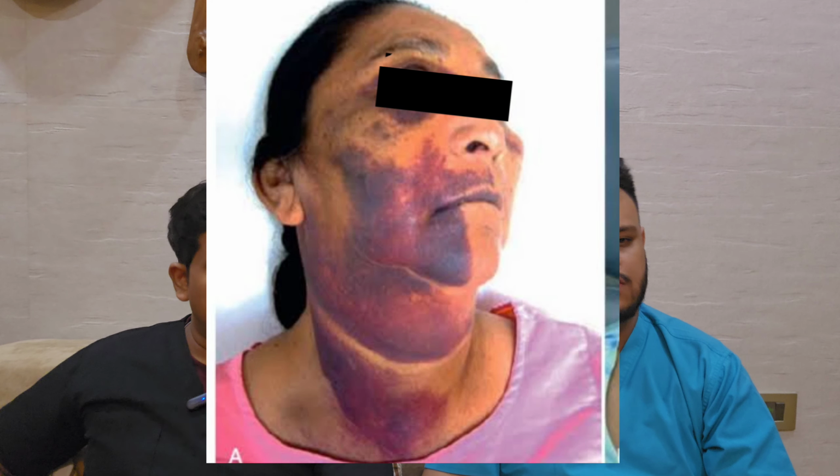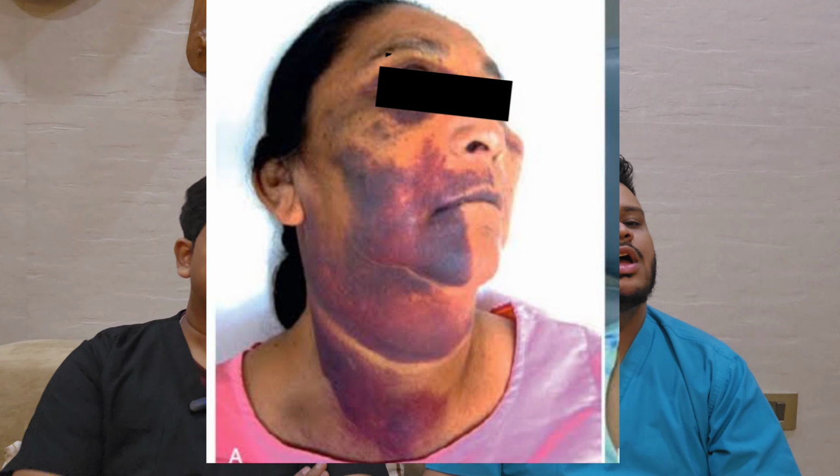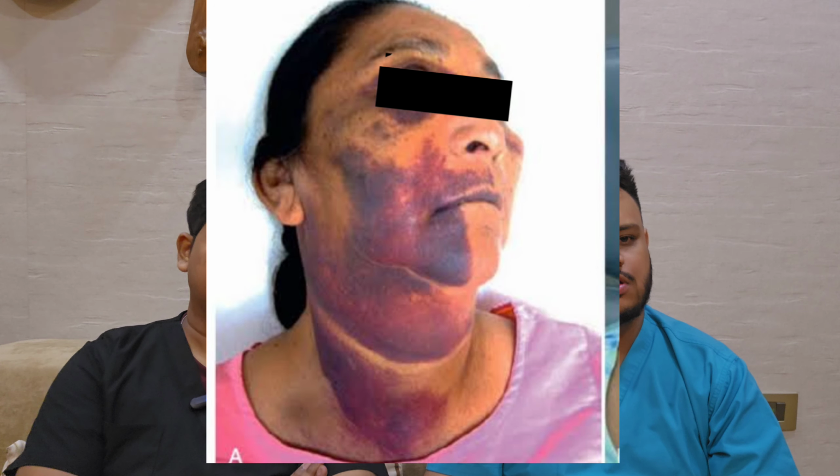We will be showing you cases. We'll be sharing some photographs of cases, how it looks when it happens, and how dangerous it is when this goes in larger quantities. A little bit here and there is okay. It happens with everybody. Yes. But when it goes beyond a certain quantity, that is owing to the lack of using proper equipment to actually administer this while doing a root canal treatment. That is the reason why this extrusion happens, and again, inadvertent pressure while injecting.